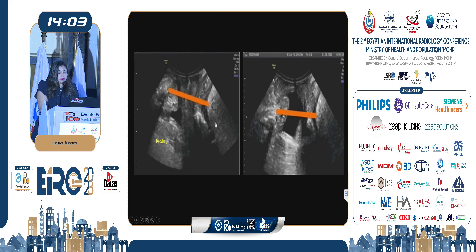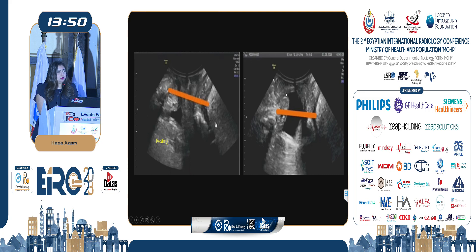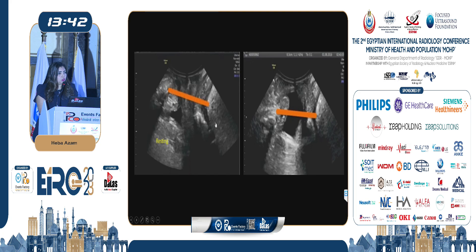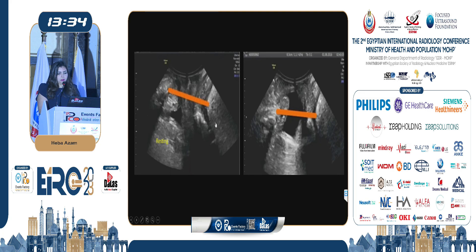Comparing the two images, during straining there is descent of the bladder base with funneling of the bladder neck, and the orientation of the urethra changes. In the resting image it shows a vertical orientation, whereas during straining it takes a rather horizontal orientation. This is due to marked urethral rotation, with a change in the echogenicity of the urethra making it less easy to identify.